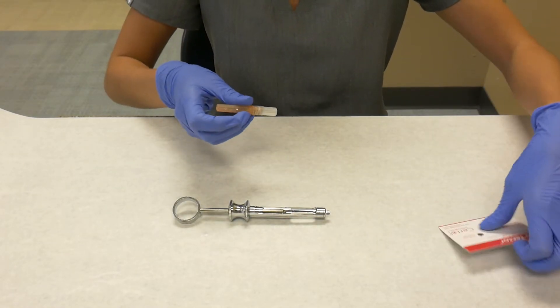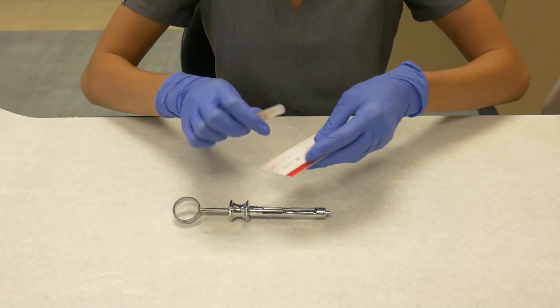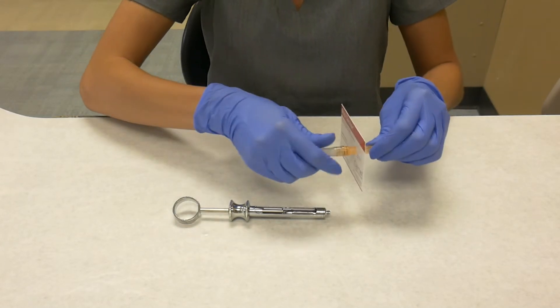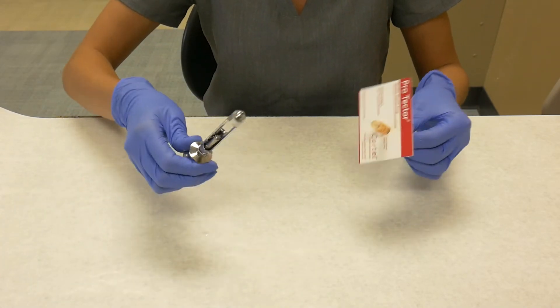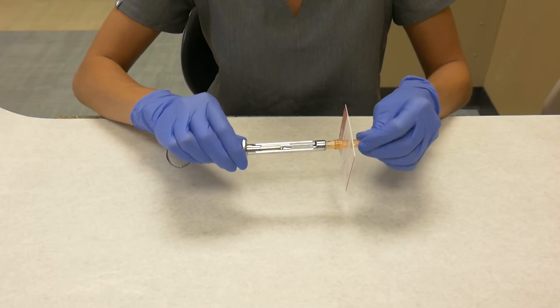Take the needle and insert it into the recapping card. Twist off the smaller cap of the needle and attach this to the threaded needle adapter of the syringe.